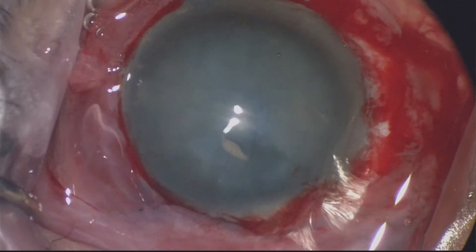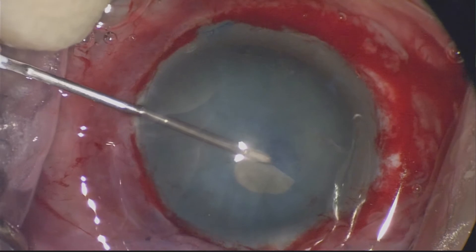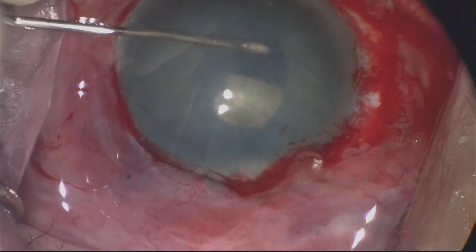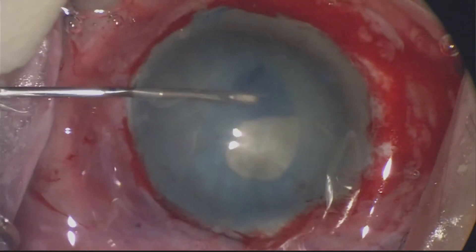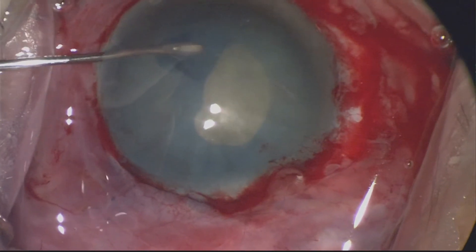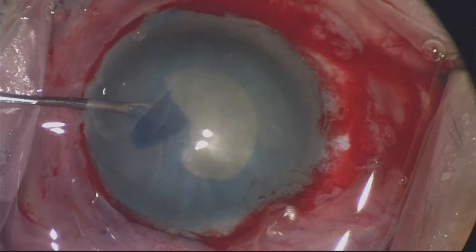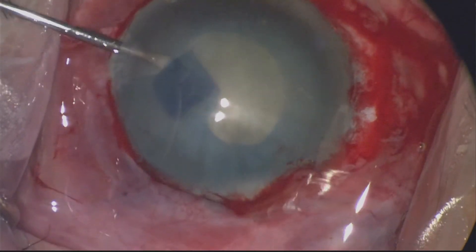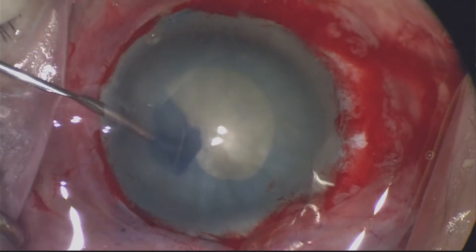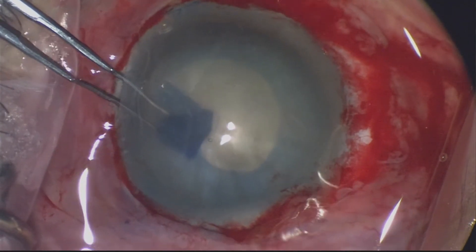Aspirating the soft lens matter is also helpful for getting a feel of what the cataract is like — whether it's soft or very hard. I use a cistotome to continue the rhexis, trying to make it as central as possible. Sizing is crucial: you don't want to make the rhexis too large or too small. For optic sizes of around 6 to 5.5mm, you want to make the rhexis around 5mm. Later, if this patient needs a penetrating keratoplasty and a stem cell transplant, you want to ensure the lens choice and position are optimal. Here I'm completing the rhexis with forceps, making it as even as possible.